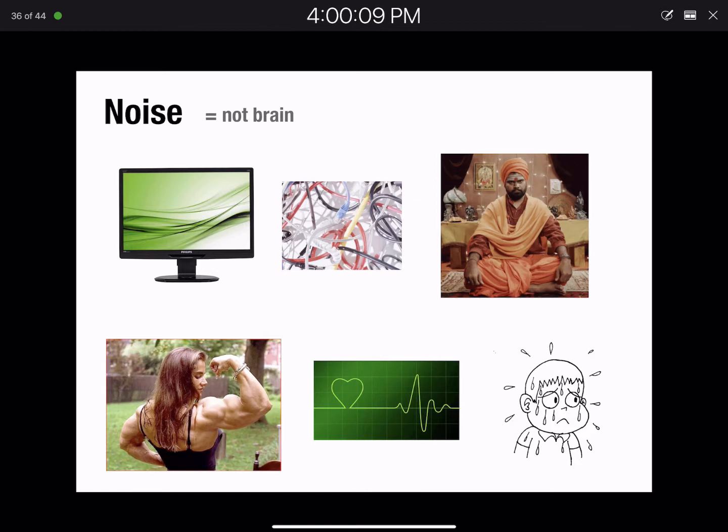If you're having people make vocal responses, the ideal thing is to design your experiment, keeping in mind that all of the ERPs we're interested in probably occur within the first second or even half second after you see a stimulus. So you can delay when the person has to make a response: they see the stimulus, there's a little pause, then they get a prompt that says, okay, now press the button. That helps isolate things. If it's a vocal response, same thing. Delay the onset of that vocal response till after that critical window when you want to be looking at the EEG, then you should be okay.